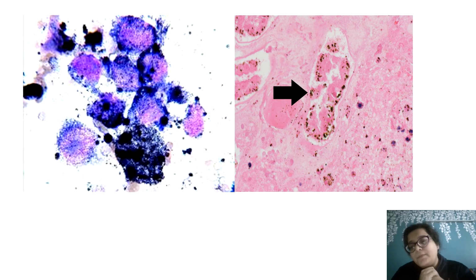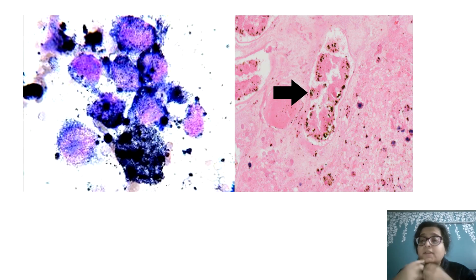So these are some common pigments that you get in the marrow. If you have any more, you can put it in the comments. These are the ones that I have come across till now in my training of pathology, or since I have been seeing the slides. So I thought, why not share with you that if you get these pigments, these pigments are very good indicators of where the disease is or what the disease is. Someday I'll do parasites in marrow also, and just put up random pictures to show you what different parasites look like.